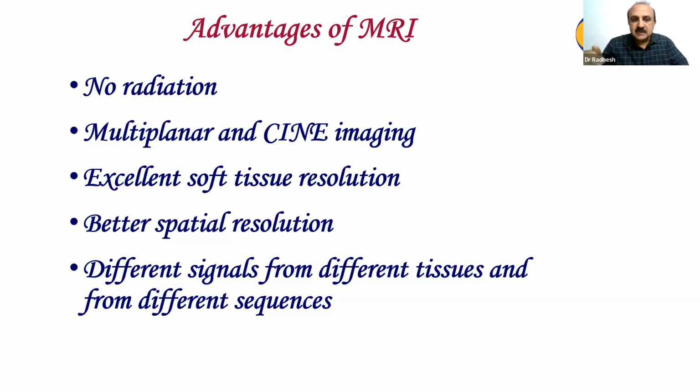Cine imaging is possible. Cine, we run it like a movie. In this talk, I'll also show you a case with cine imaging, where you can see systole and diastole.